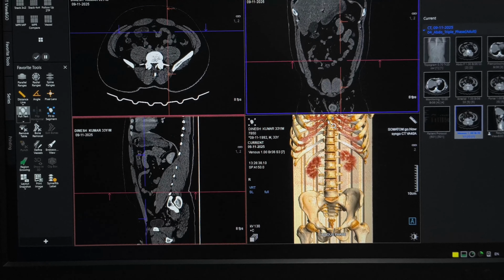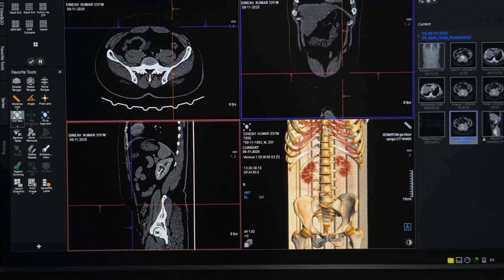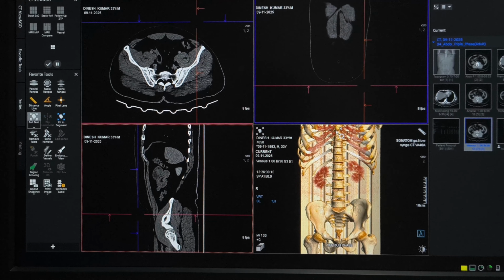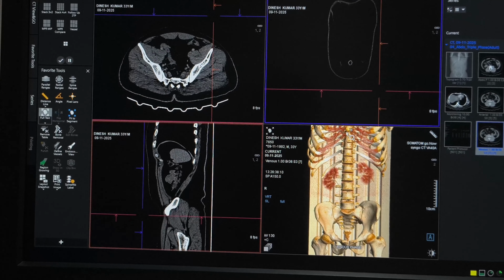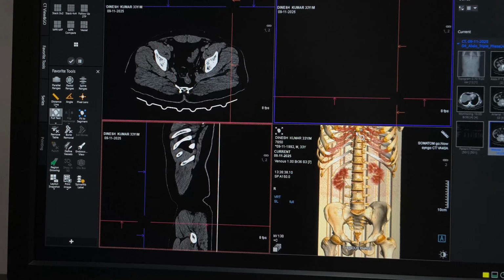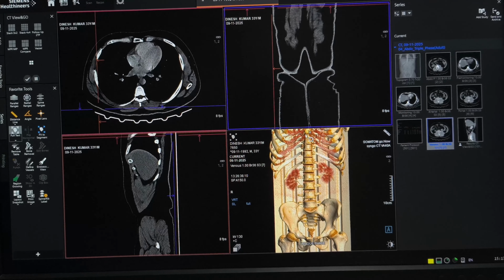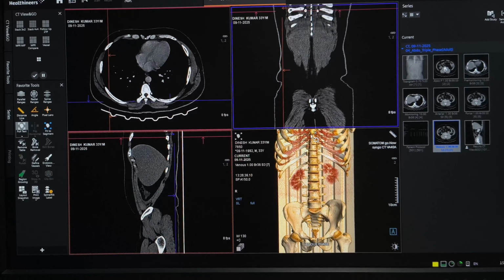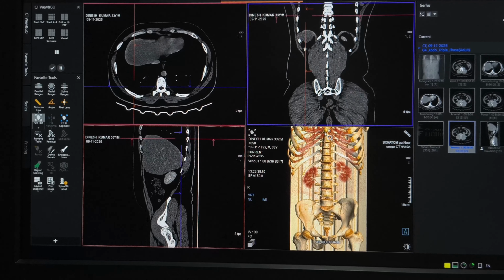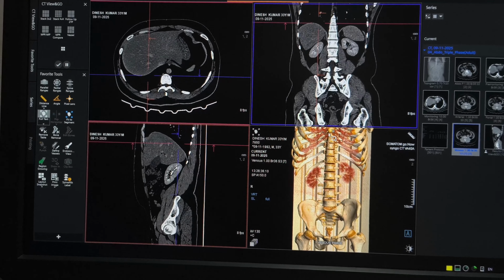Best seen: soft tissue structures, whole body veins, lymph nodes, tumors and masses, chest, abdomen, pelvis evaluation, etc. Important note: venous phase timing is not fixed. Some scanners might capture it at 60 to 70 seconds, others at 80 to 90 seconds, depending on patient circulation, body size, cardiac output, injection speed, scanner algorithm, etc. So timing varies from patient to patient.